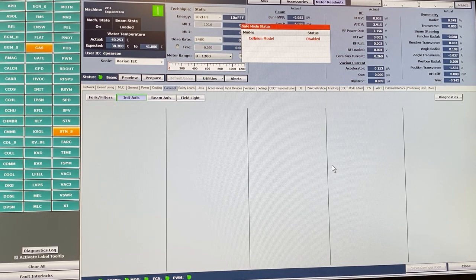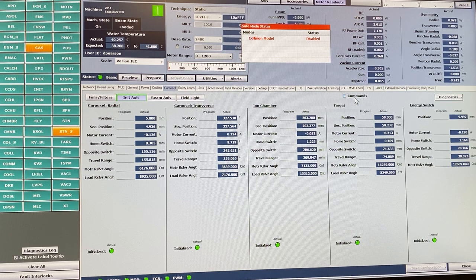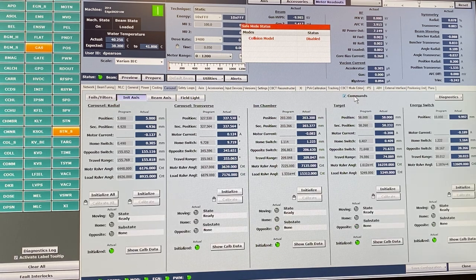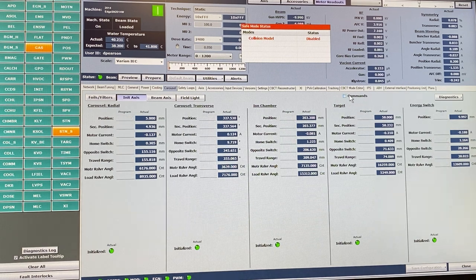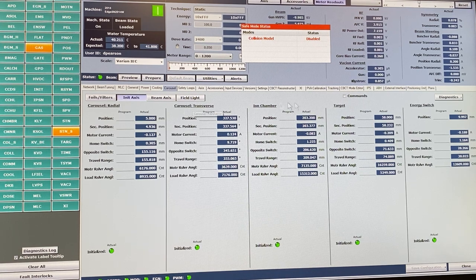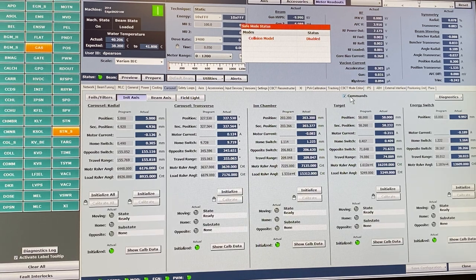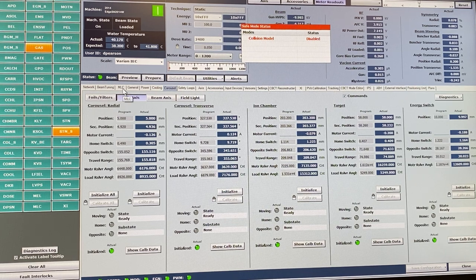This is where you initialize the carousel. To reinitialize it — which is needed whenever the machine is turned off — you have to hit the Commands button first, and then you can hit Initialize. Right now all parts of the carousel show as initialized: the energy switch, ion chamber, and so on. This is a bit tricky because unlike the MLC tab which had an Initialize button visible right away, here the button is hidden until you hit Commands. People often miss this step.